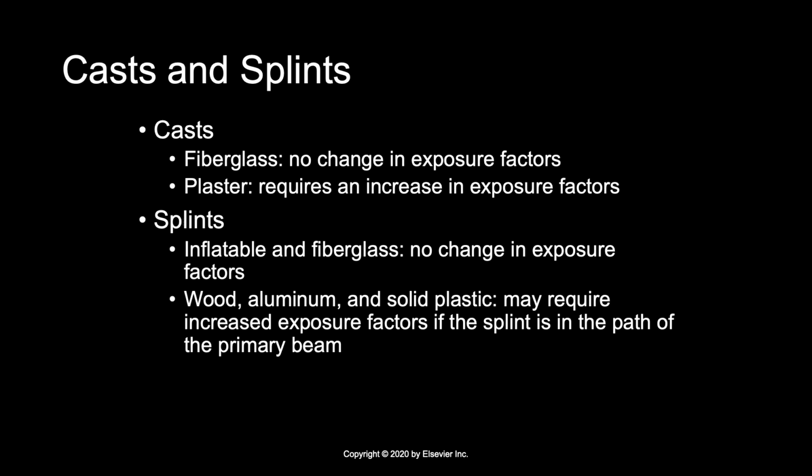Splints present less of a challenge in determining the exposure factors. There is an inflatable air splint and fiberglass splints, and they do not require any increase in exposure factors. But then there are wood, aluminum, and solid plastic splints, and they might require exposure factors to be increased, but only if they are in the path of the primary beam.